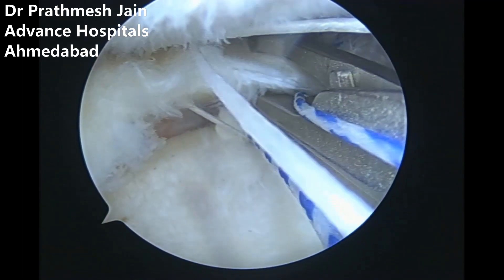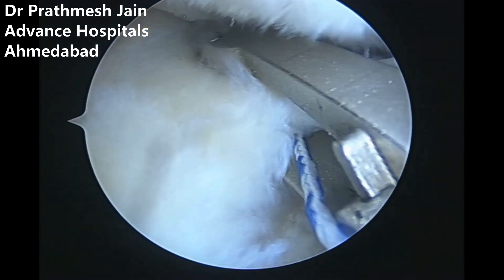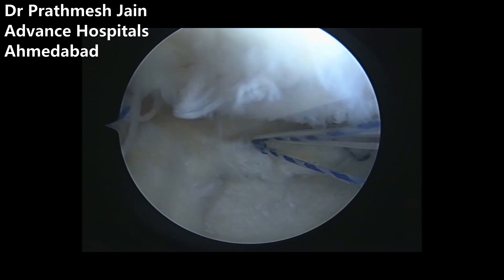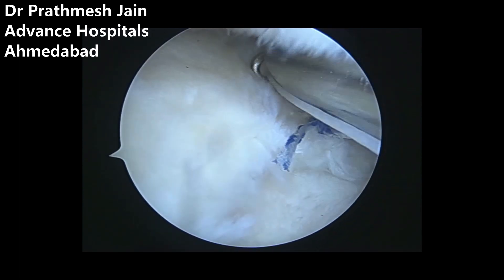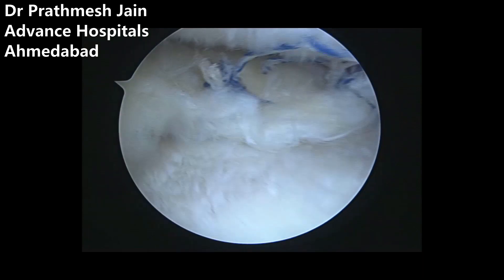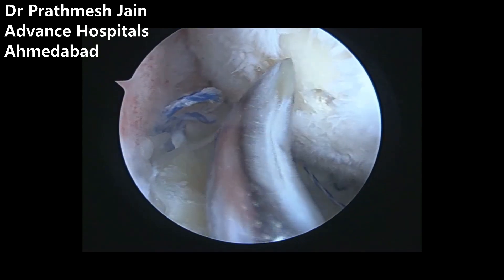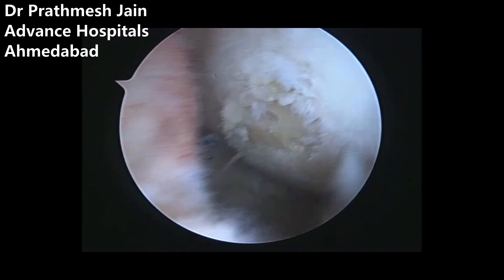By doing this surgery we are making a non-functional meniscus into a functional meniscus by shifting it back into the joint. The philosophy is to make the meniscus functional, thereby restoring its shock-absorbing cushion-like function between the femur and tibia. In the final picture, we have placed four anchors total: two X-fix anchors anteriorly and two root fixed anchors posteriorly. We can also perform microfracture on the chondral defect on the femur to complete the surgery. The procedure has very promising short-term results.